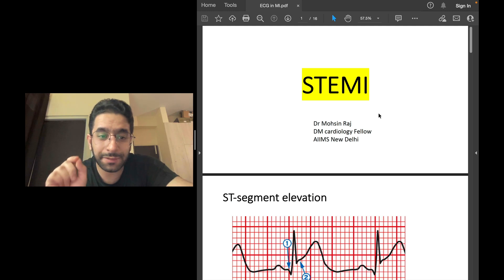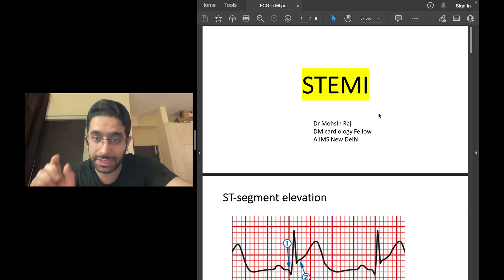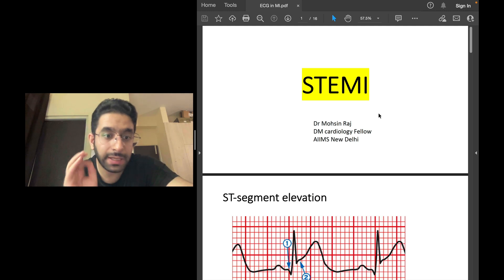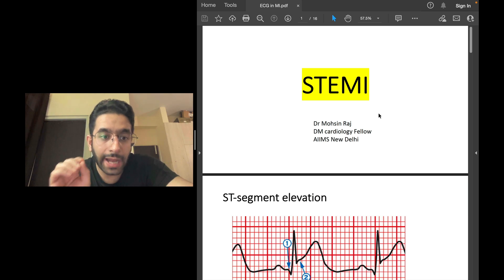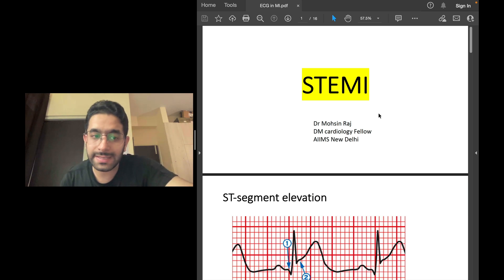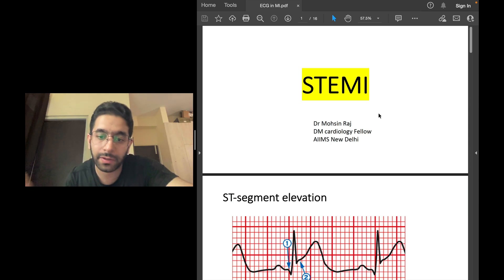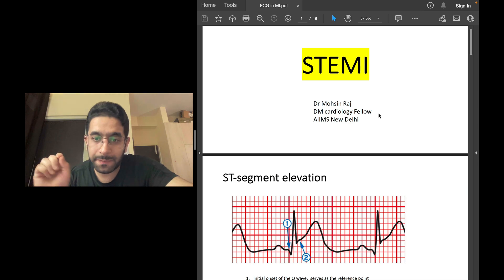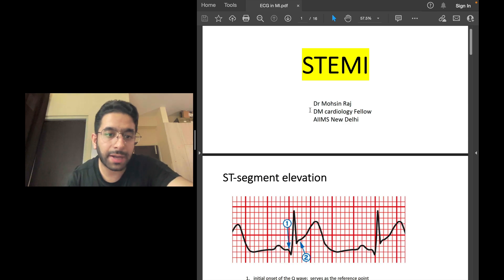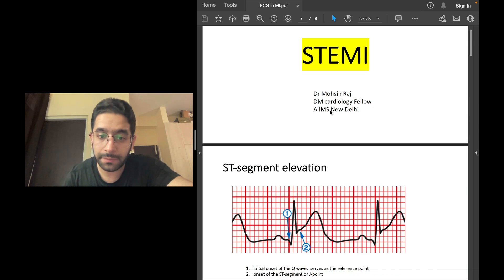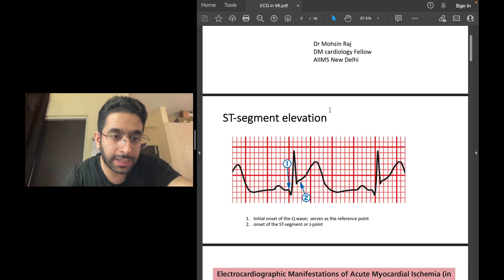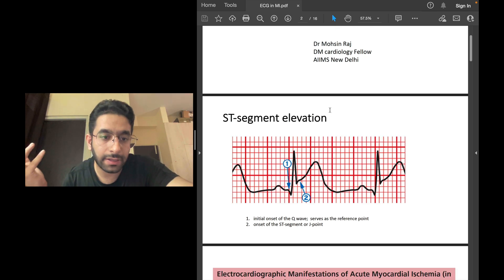This patient — ST segment elevation myocardial infarction — requires immediate referral and immediate treatment. This is also high-yield for your exams, for NEET PG or INICET, because this is a basic ECG that every doctor should recognize. I work as a DM cardiology fellow at AIIMS New Delhi, so I'm involved in the care of cardiac patients every day.